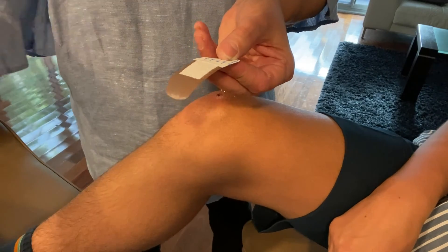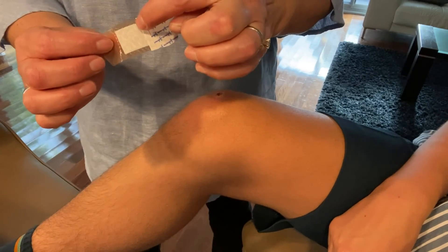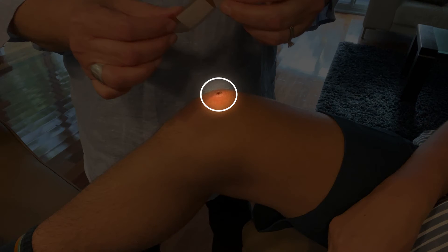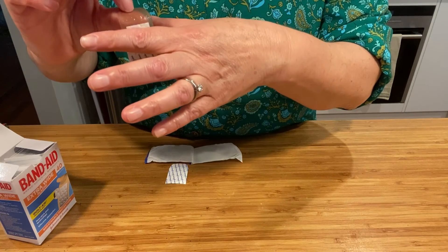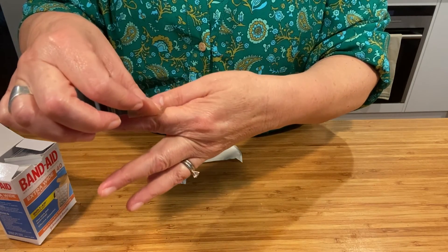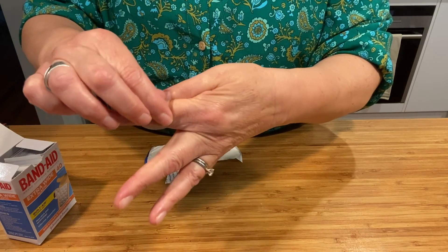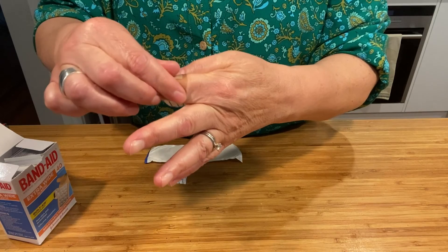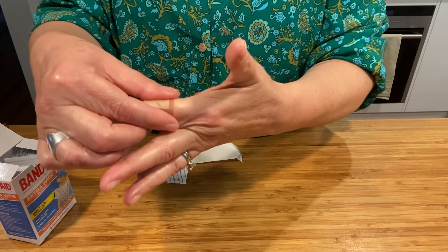With one of the back covers now off and you holding the sticky part of the band-aid, look for the injury and place the gauze pad part right on top of that injury. Now that the gauze pad is on your injury, it's time to start pressing the sticky part to your skin. Use a finger to press it down so that it stays in place.